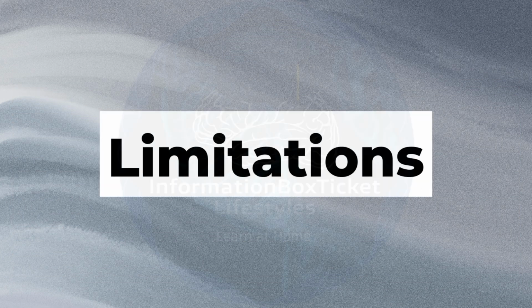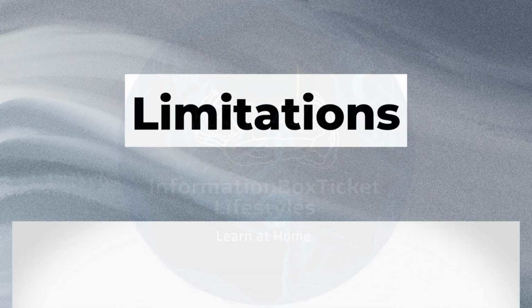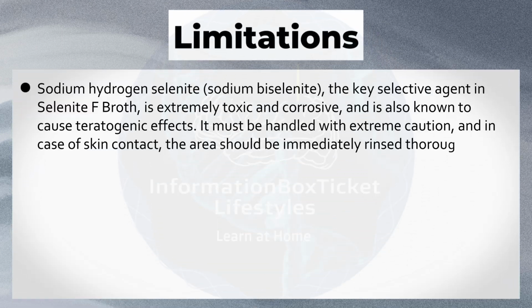Limitations of Selenite F broth. Sodium hydrogen selenite, sodium biselenite, the key selective agent in Selenite F broth, is extremely toxic and corrosive, and is also known to cause teratogenic effects. It must be handled with extreme caution, and in case of skin contact, the area should be immediately rinsed thoroughly with plenty of water to minimize harm.